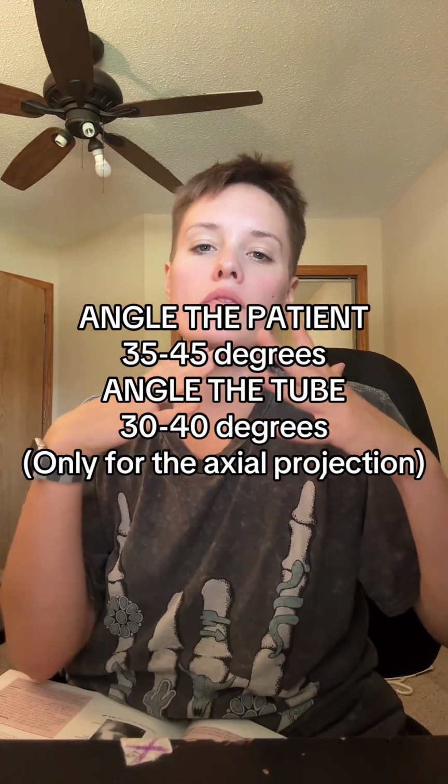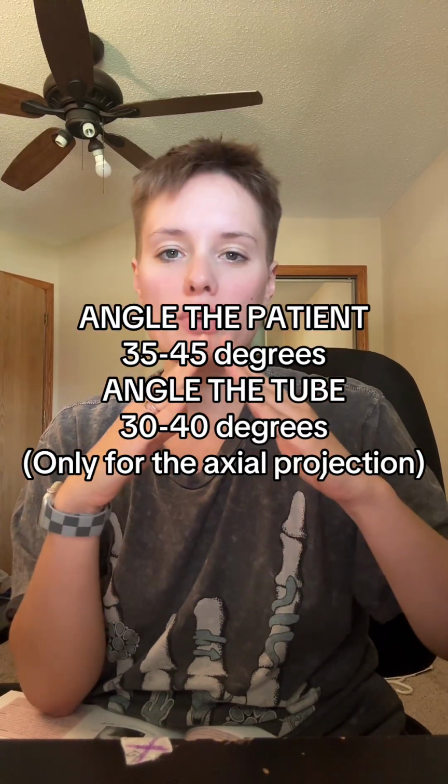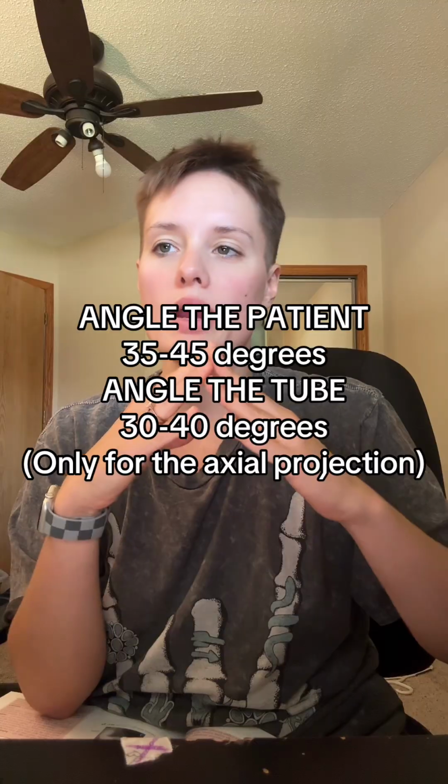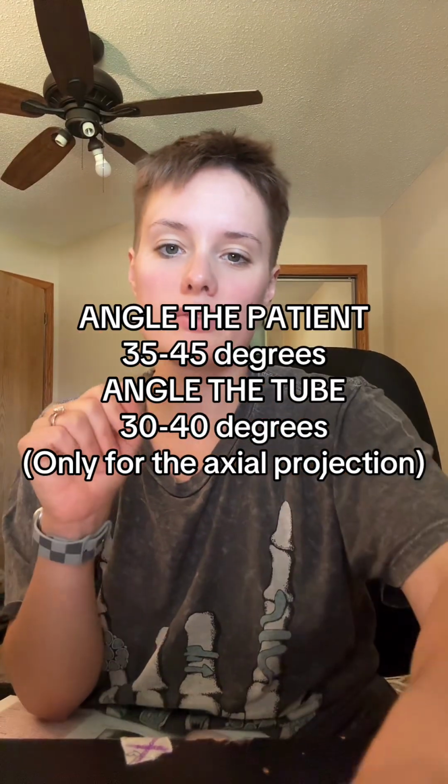And here's how we remember all of these degrees. It's somewhere between 35 and 45 for how we put them in the RPOs and LAOs, and it's the same way with how to angle. So it's about 30 to 40 degrees angling either up or down. LPO, up the butt. RAO, out the ass. I can't believe any of you are taking me seriously right now.